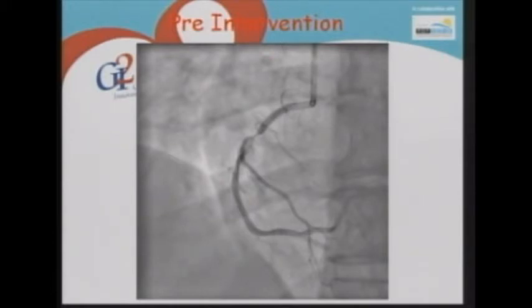For the right ventricular branch, it could be an issue, but it's not forbidden to dilate a side branch. It depends a little bit on what technology you have with the bioabsorbable. There are at least 6 in clinical use now, so each has its technique.